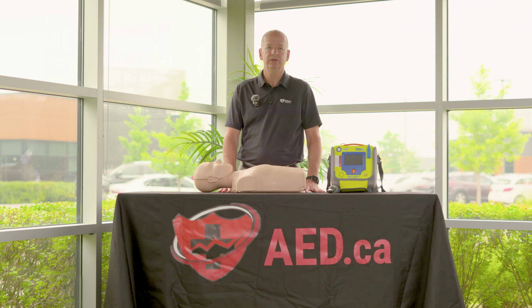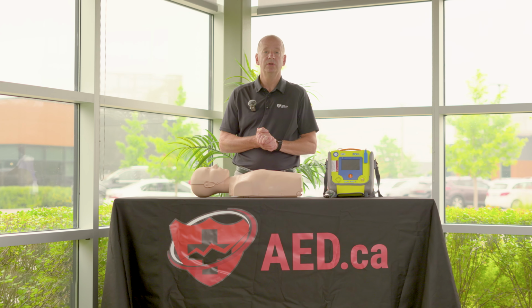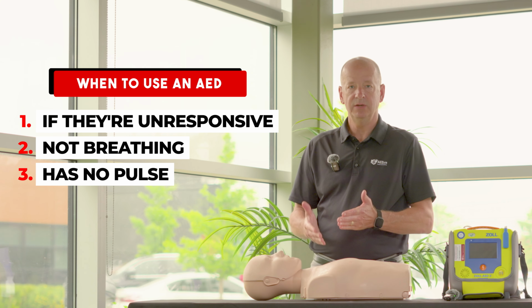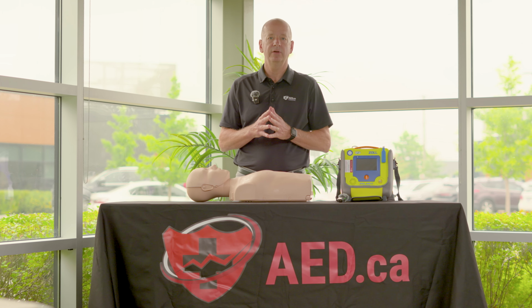Today we're going to show you how to use an AED. AEDs are simple to use and they're designed for anyone to use. Formal training is not required. The basic criteria to know when to use an AED is if a person is unresponsive, not breathing, and has no pulse.